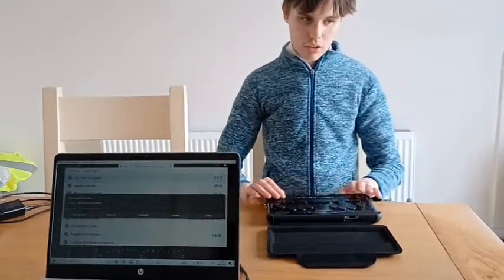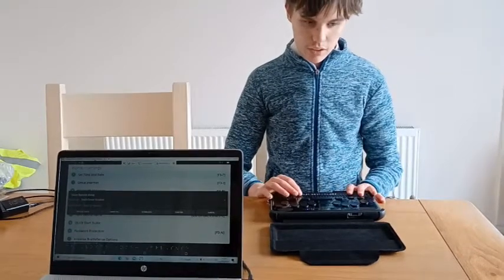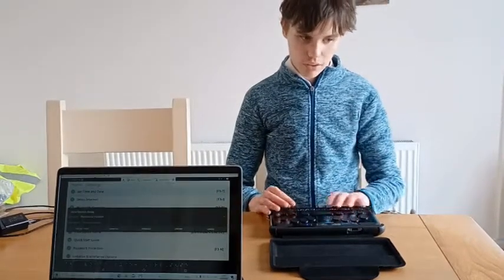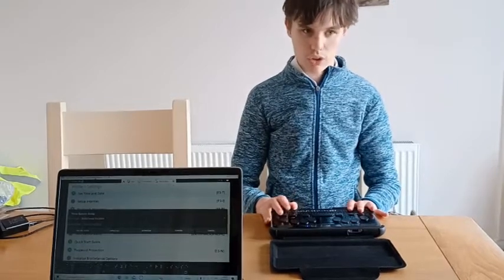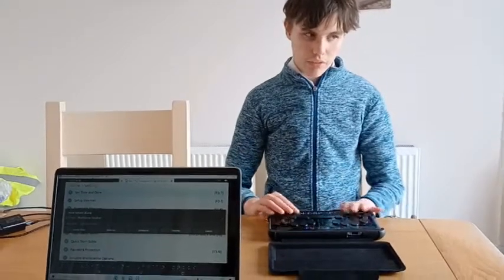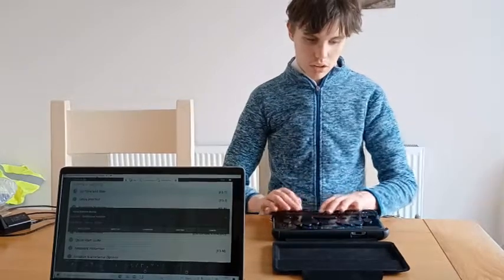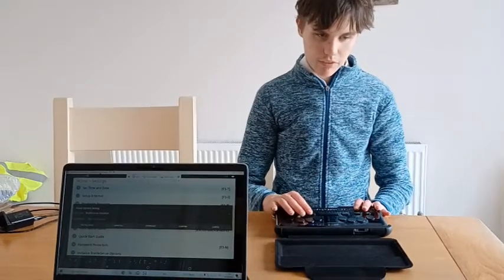Voice type, Braille Sense Vocalizer combo box. This is the text-to-speech that it will use. The options are Braille Sense Vocalizer or Google's voices. So I will leave it at Vocalizer. I'm moving through this using space and dots 4 or 5. So I will press it again. Uninstall, space D, button. Uninstall. This lets you remove a language that you no longer need.